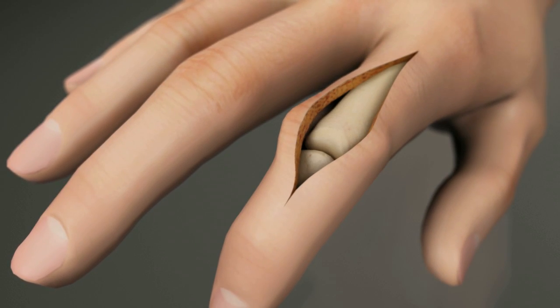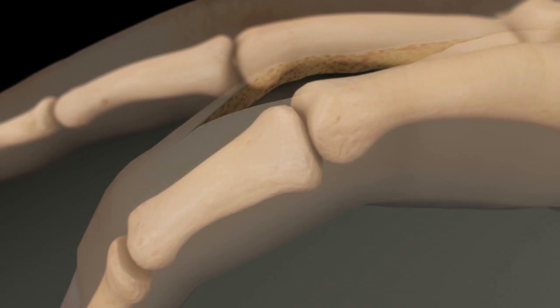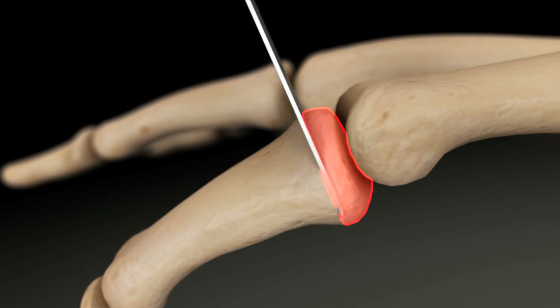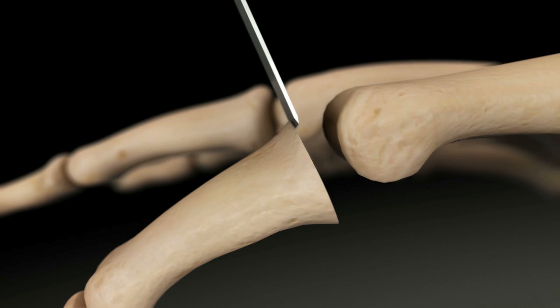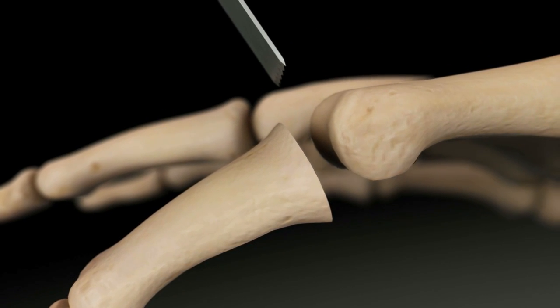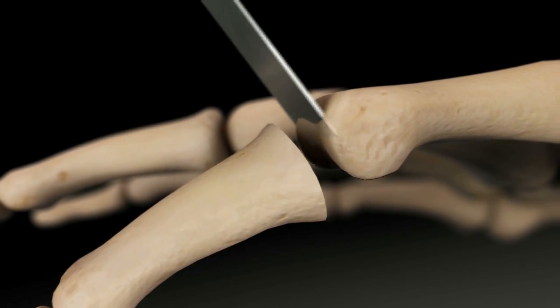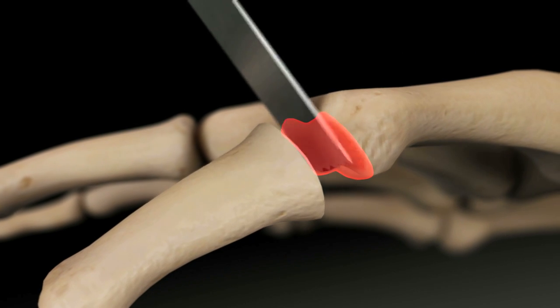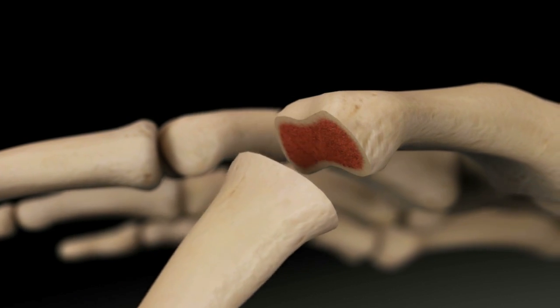Expose the joint by making an incision dorsally on the proximal side of the joint. Remove the damaged joint surfaces. Cut the distal bone perpendicular to the dorsal surface. Angle the proximal bone cut to the angle of fusion desired. A cup and cone technique can also be used.